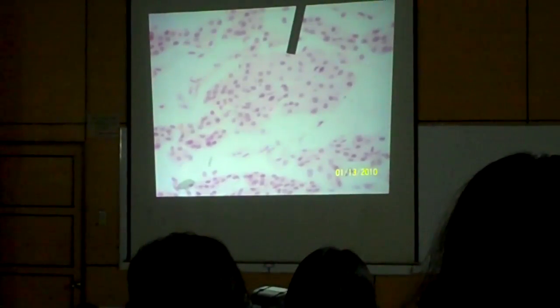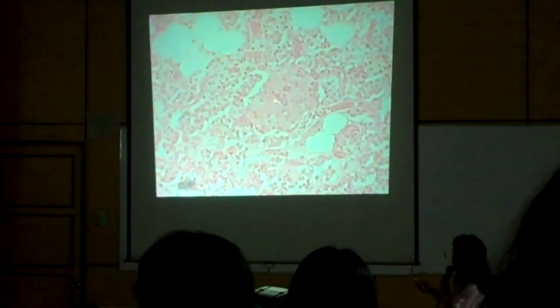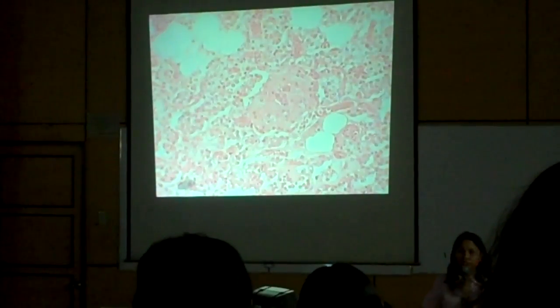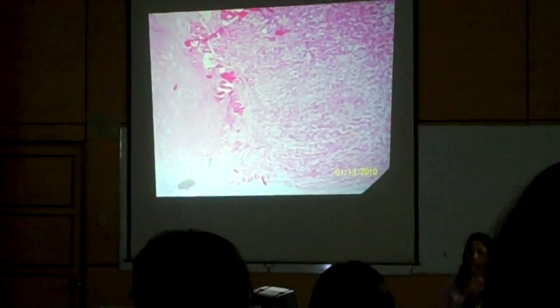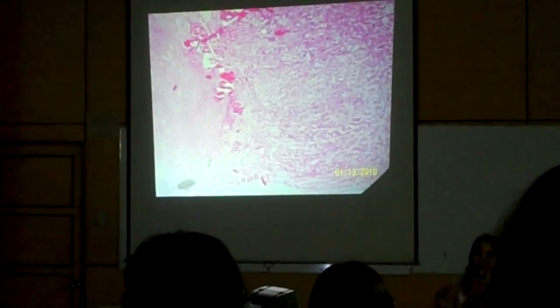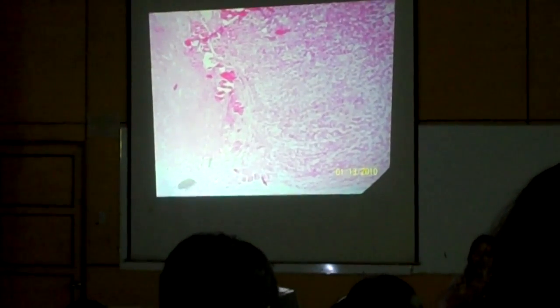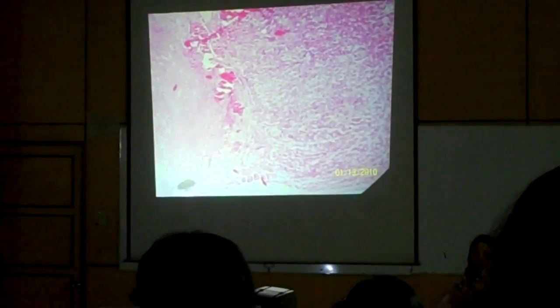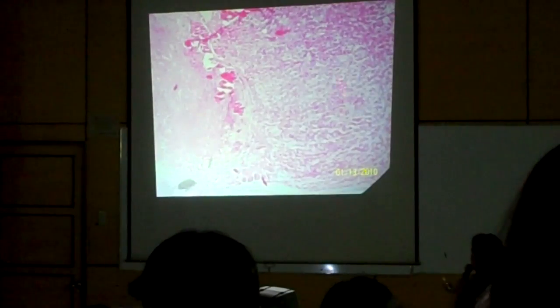This is actually from your slide box, that's why it's that color. So this is better. You can see that it's larger, more pink than the surrounding chief cells. So those are the possibilities in all of the endocrine organs. You need to identify the organ, identify the cells, and the hormones that they secrete. The questions for endocrine will revolve around that. In the practical exam, identify the whole organ.